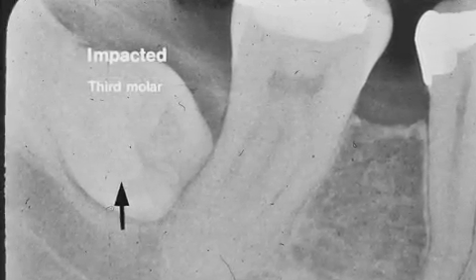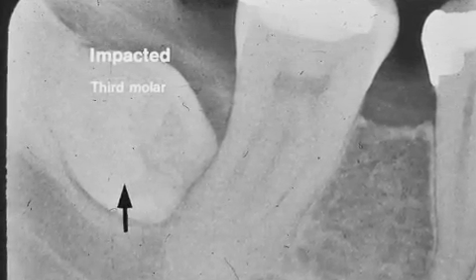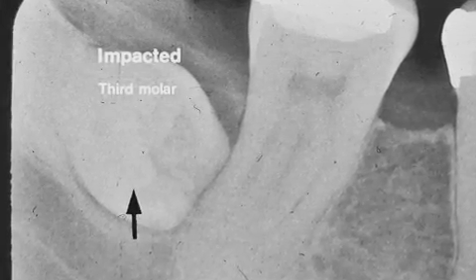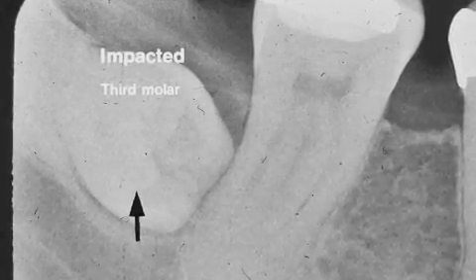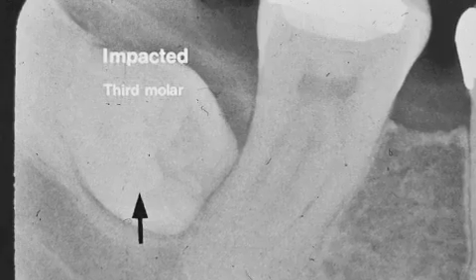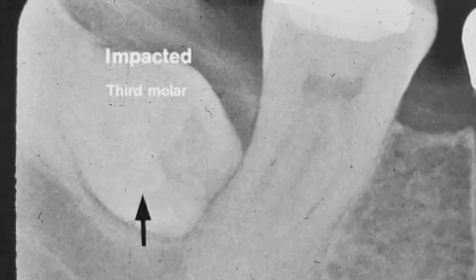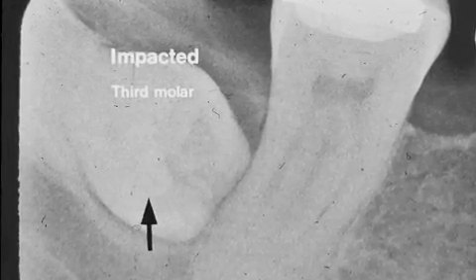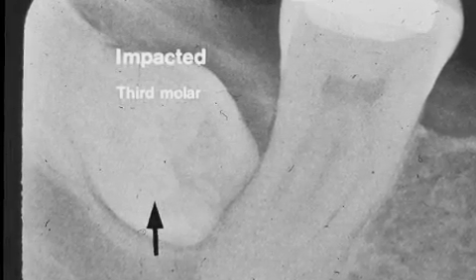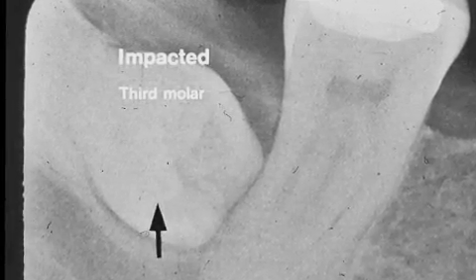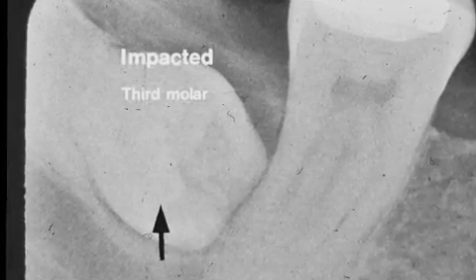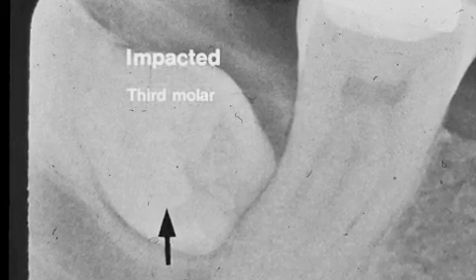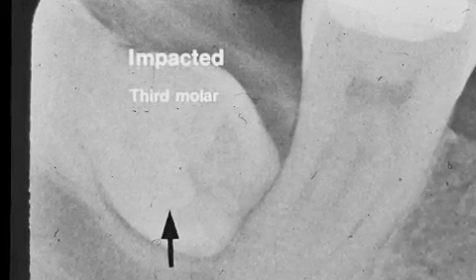Tooth number 32 is an impacted third molar. Will it ever erupt properly? No. It is also known as ectopic eruption — erupting out of position. What are some problems that could occur with this tooth position?